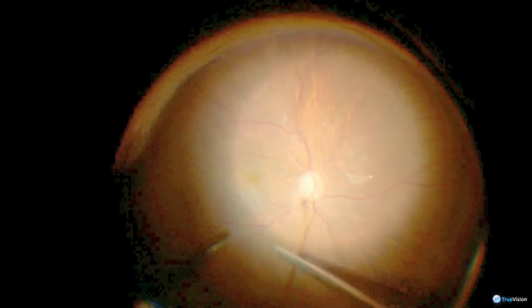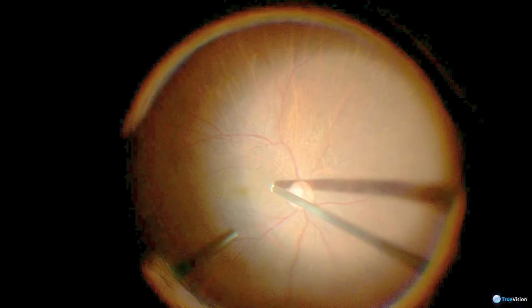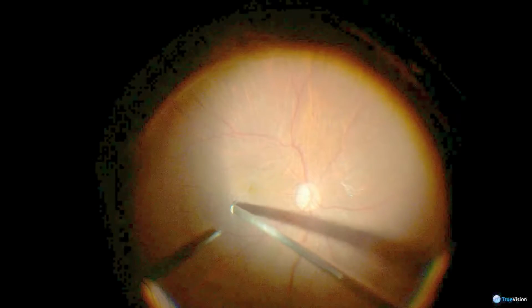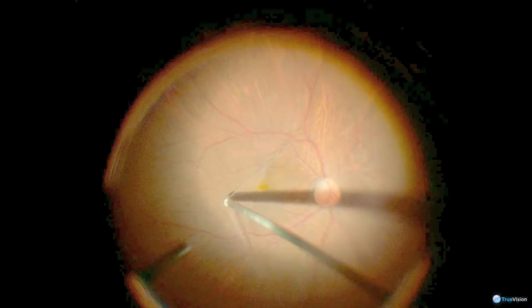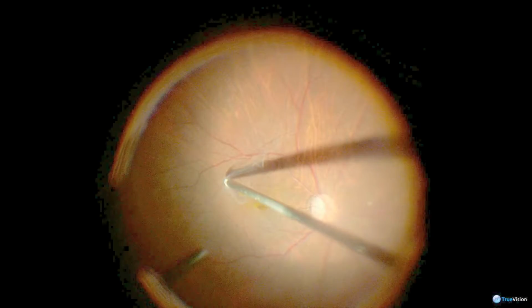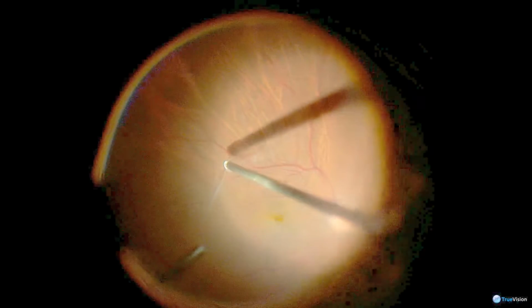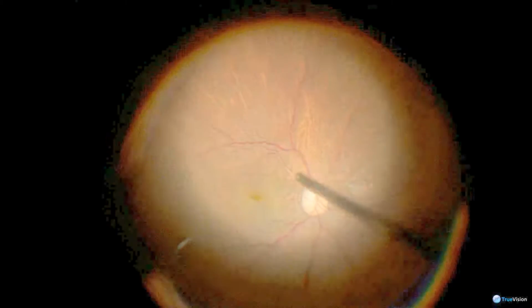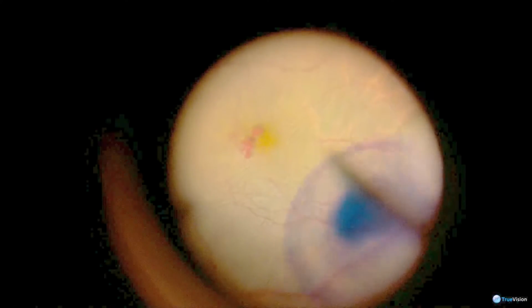Here, using the TrueVision heads-up system, I'm showing membrane peeling with the 27 gauge system. You can see here that the epiretinal membrane comes out quite nicely with the vitreous cutter because the sphere of influence of the 27 gauge is so small, and therefore the cutter is so accurate.